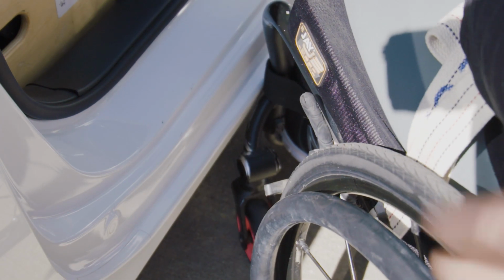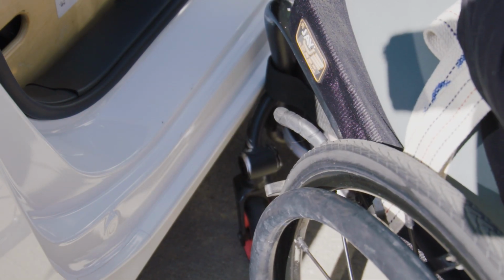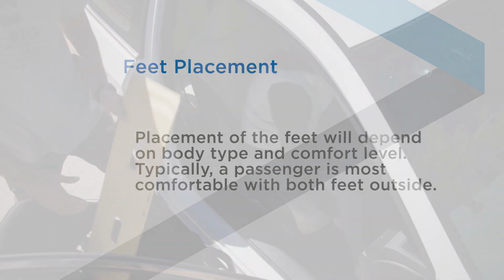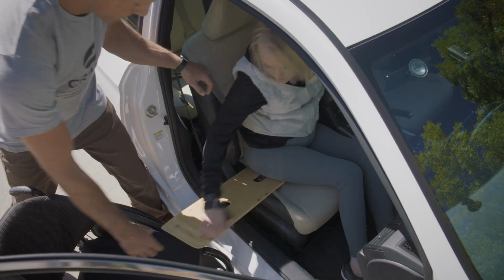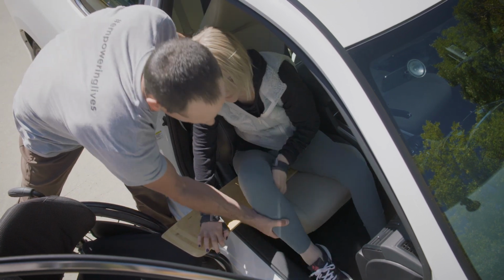Start by placing the chair at about a 30-degree angle to the vehicle frame. Lock the brakes. Placement of the feet will depend on comfort level. Typically, people are successful with both feet out of the car. The passenger will lean away from the wheelchair. The assistant will place about 1/3 of the slide board under the upper thigh and buttocks. The passenger will lean forward.